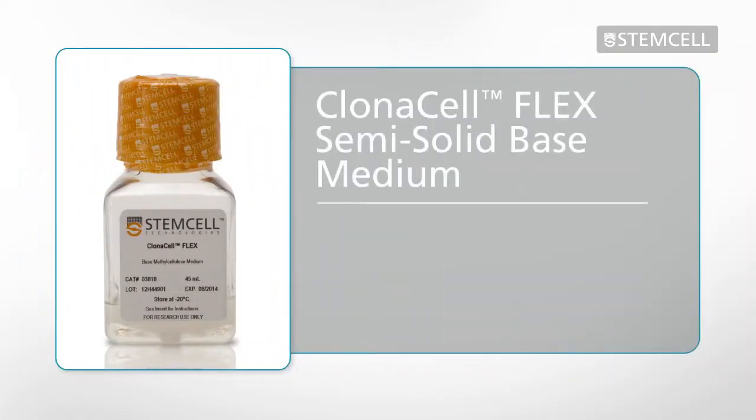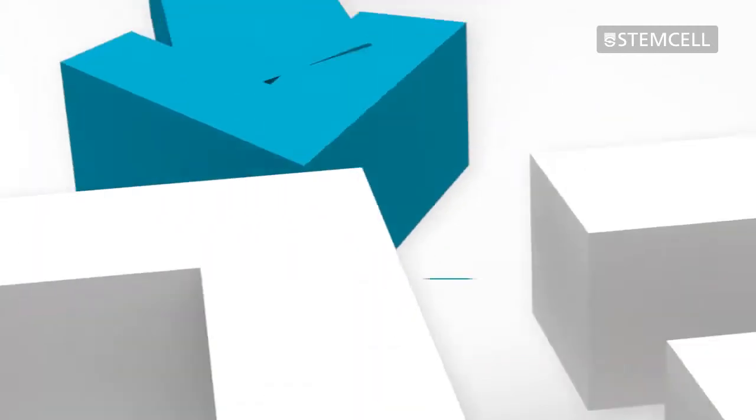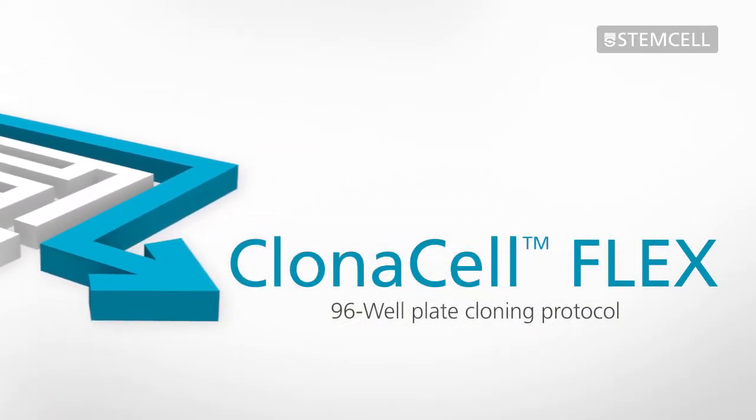ClonaCell Flex semi-solid base medium is designed for cloning a wide variety of cell types. By adding a 2x concentrate of your own liquid cell culture medium, you can create a semi-solid cloning medium that is customized to your own cells and processes. This video will cover the 96-well plate protocol for semi-solid cloning with ClonaCell Flex.